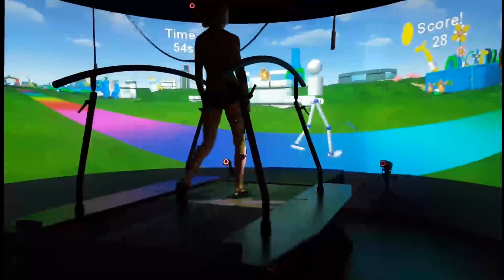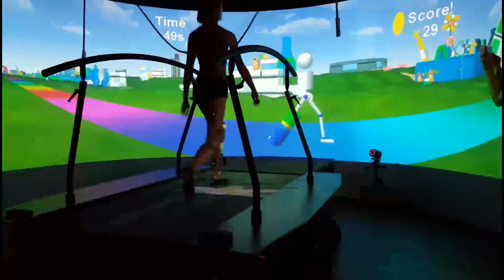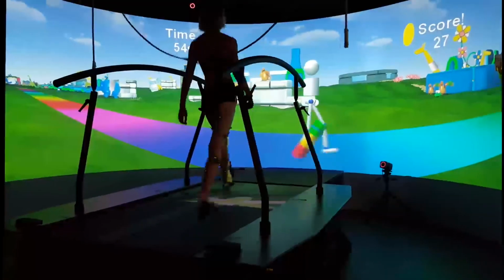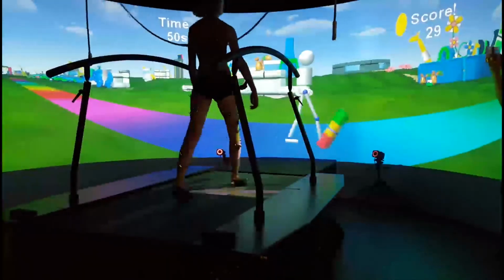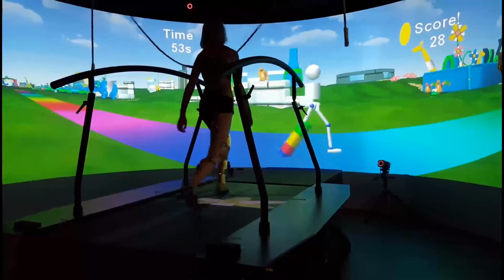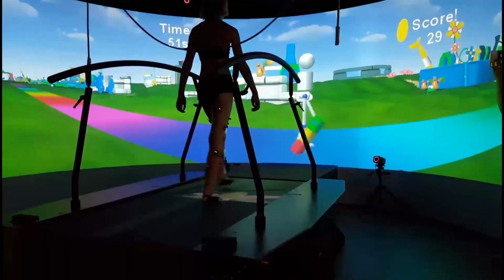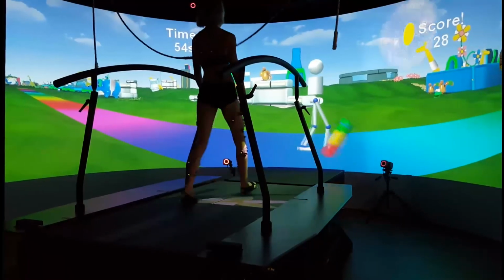So here you'll see what that looks like. The cylinder that's drawn on top of the ankle on the right side will show red, yellow, and green, and then the blue bar is actually how strong you did your push-off. When the blue bar reaches up into the green, you know you're doing well. When it's in the red, you're not pushing hard enough.